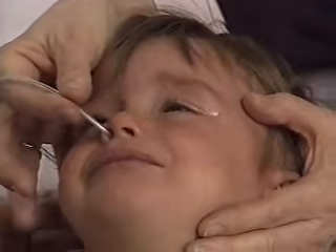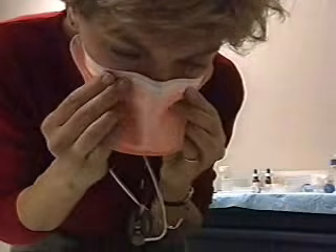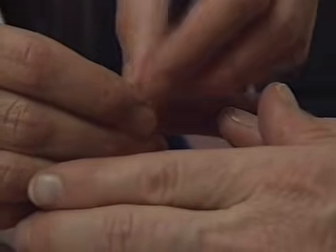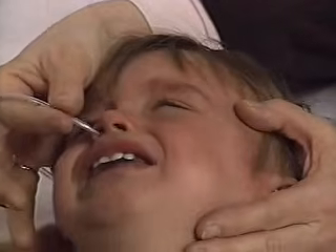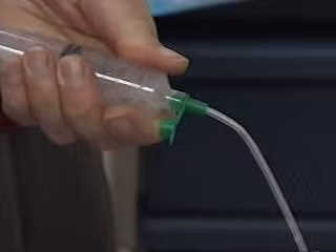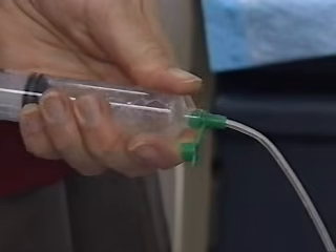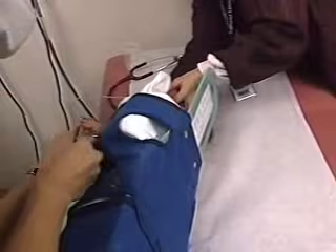Pass the tube into the throat. If the child doesn't swallow, take a breath, pull your mask away, puff into the child's face, and replace your mask. This maneuver frequently elicits a swallow. Look to make sure that the tube is not coiled in the mouth. When the tube reaches the pen mark, aspirate with the syringe. If no mucus returns, advance the tube slightly, roll the child on his or her side, aspirating with the syringe the whole time, looking for the mucus pool in the stomach.